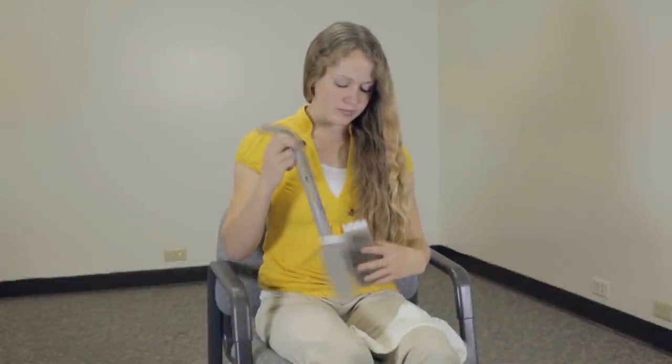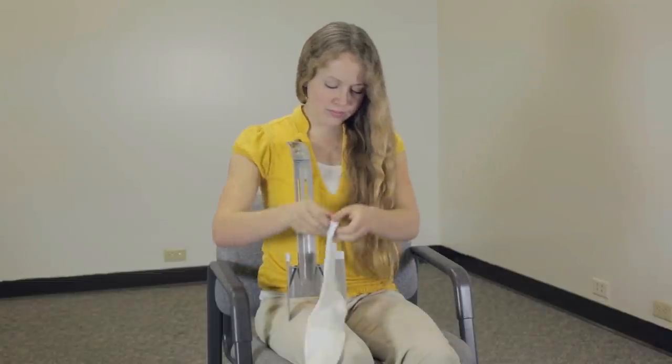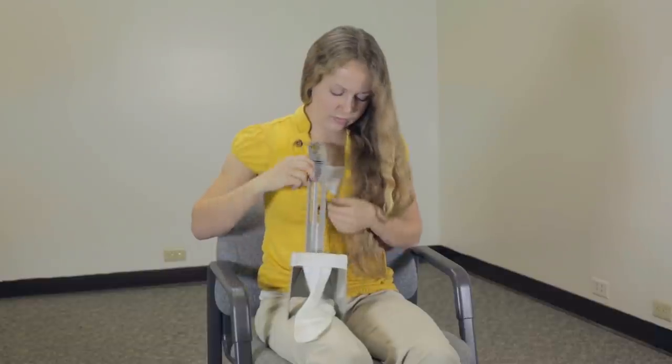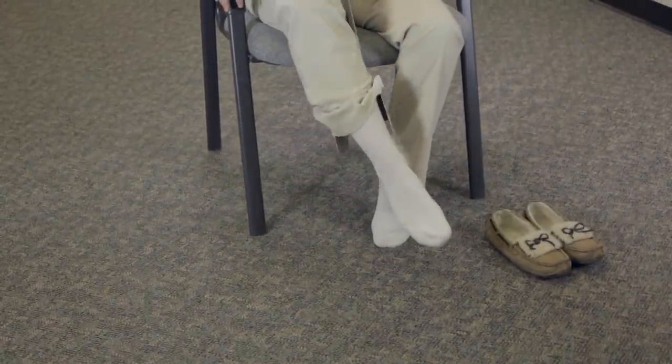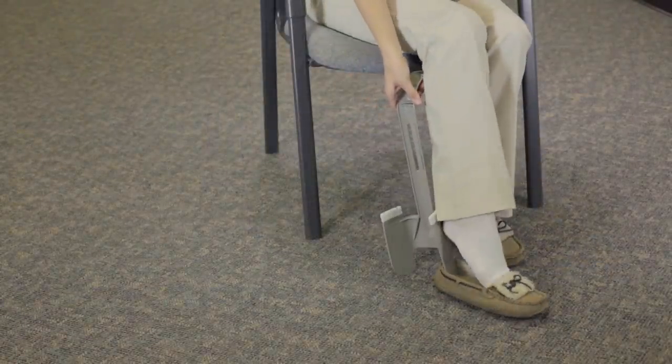Some people prefer to place the Sock Horse on top of their leg with the handle leaning against their chest. The Sock Horse also works as a long handled shoe horn.